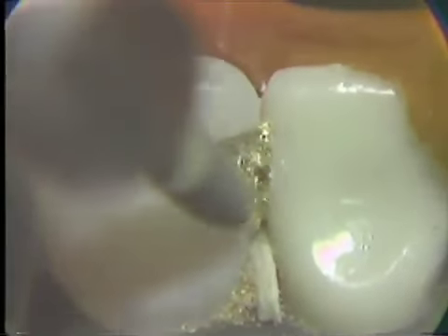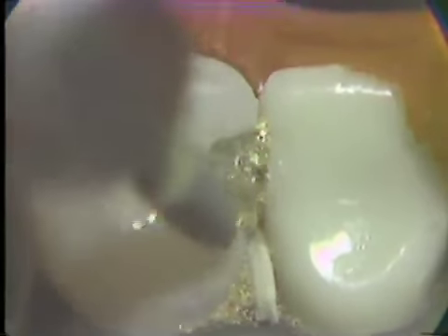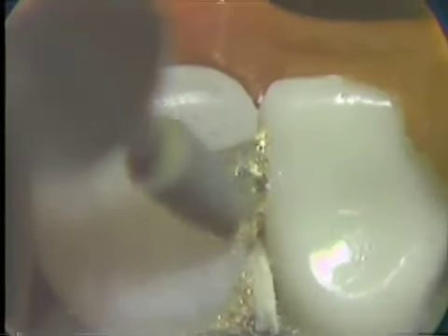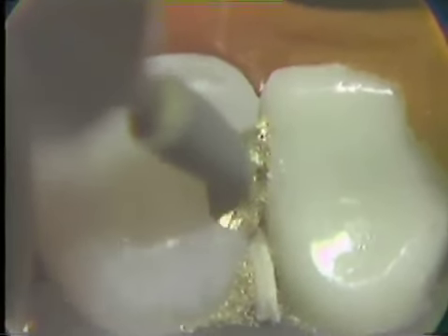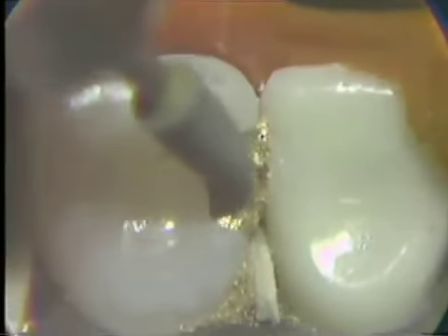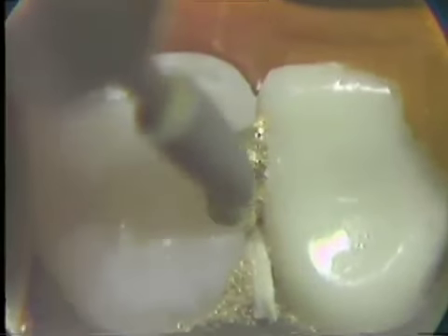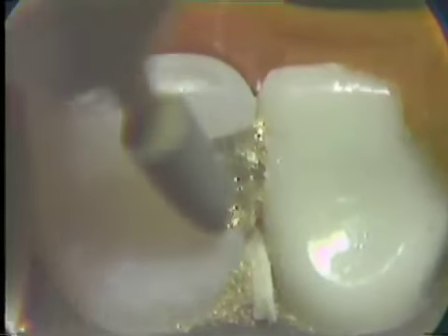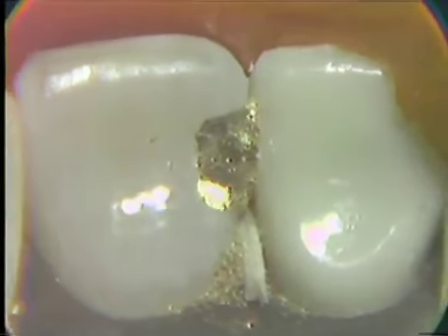Doing this all, of course, with our labial matrix still in position. This gives us complete stability and also convenience here as far as finger rest is concerned. So we'll continue on the contouring of this lingual area with the rotary instruments, and then we'll carry out the removal of the matrix itself.